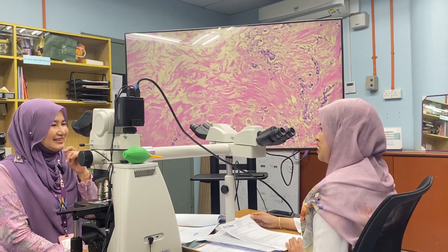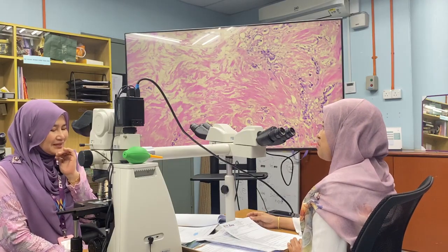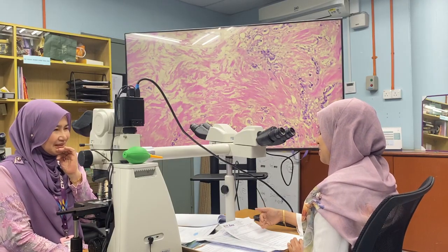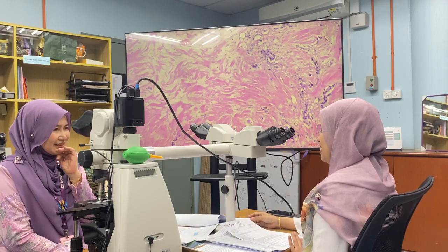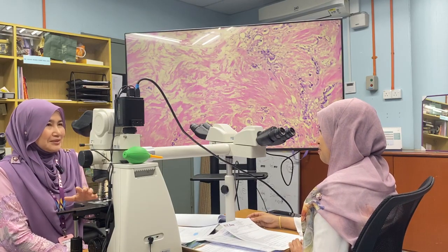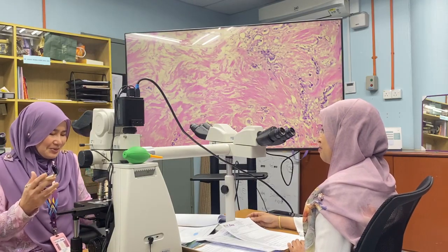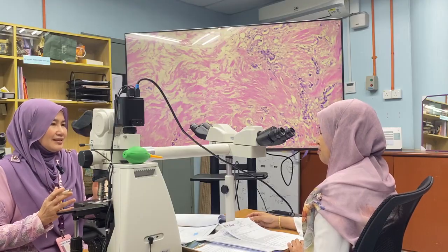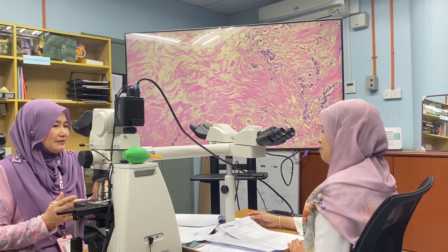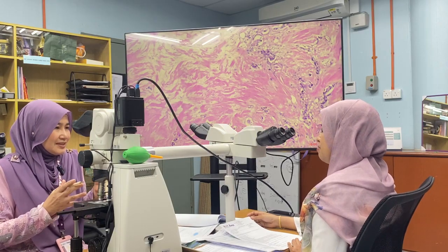I think it will persist, but have changes also. Because chemo targets all tissue, healthy and cancer cells. We cannot say it will be totally responsive, with no more DCIS. I think that's quite impossible. But what we need to do is to assess the cellular changes, the cells within the DCIS.